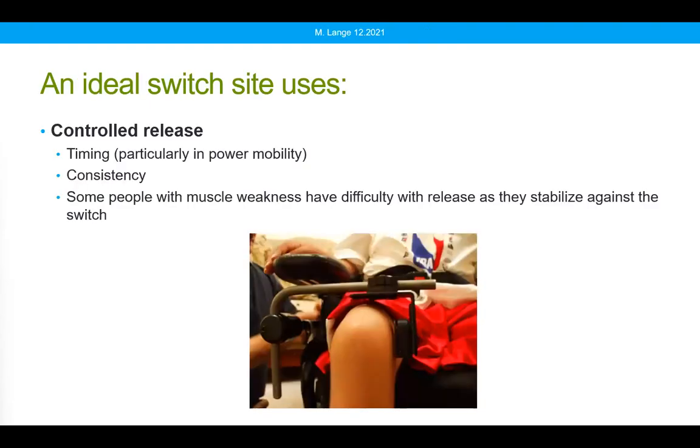So this mount here on controlled release, thank you, Jennifer, is actually called a Gatlin mount, and it's made by a number of companies. This one here might be made from Stealth Products, and it's mounted underneath the arm pad. It's often used to mount a joystick when we don't want it at the end of the arm pad, where we need it closer in, but this happened to work to hold it where we mounted this particular switch. We then just took a simple L bracket and attached it to the Gatlin mount to support the Microlight with some Velcro. This allows us to swing it out of the way for transfers, because otherwise this would obviously be a problem.